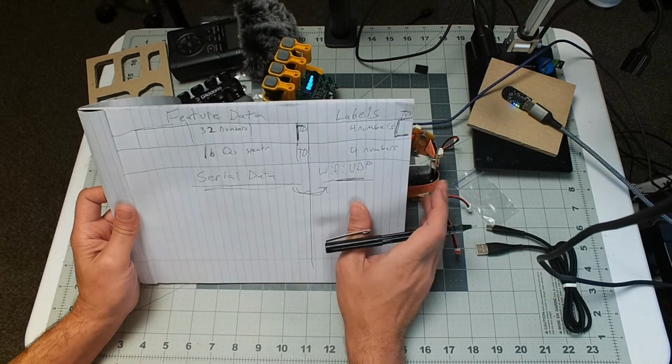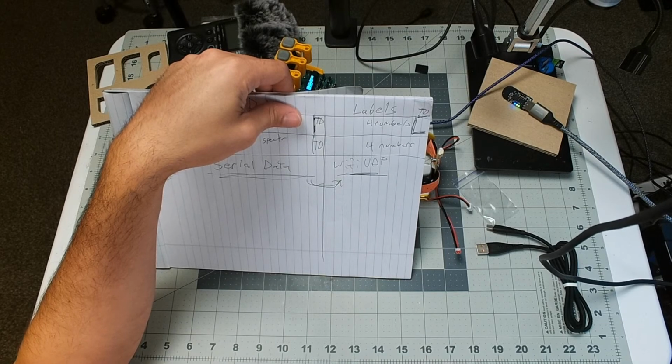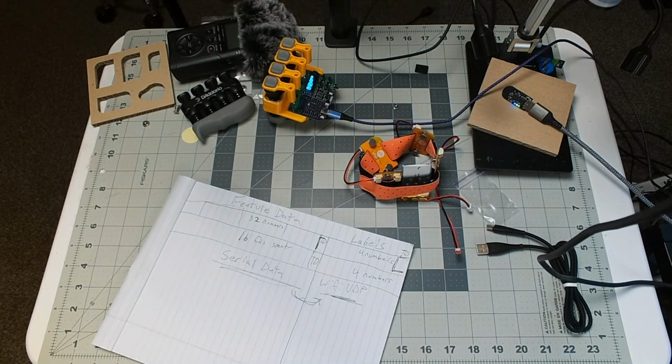Now this is important, and I didn't know this last time, but Joe says, sorry, my English is bad, but what I meant is, let's say you have 4 connected and I want to turn them on. Do I just click the button on one of them and they all turn on? That's going to be difficult. I don't know how that can be done because this battery sends a signal to turn it on, and there's no way to tell the device to turn on except for the button.